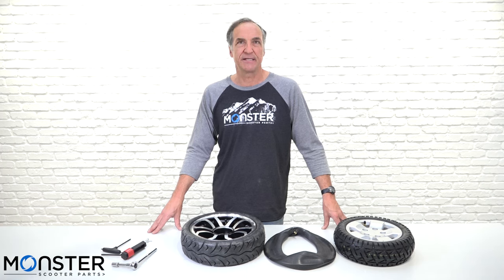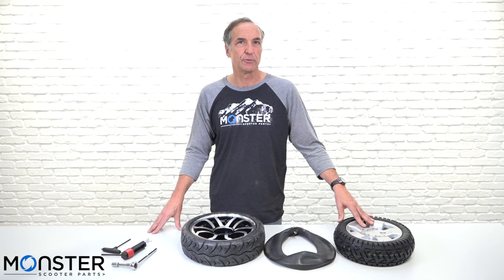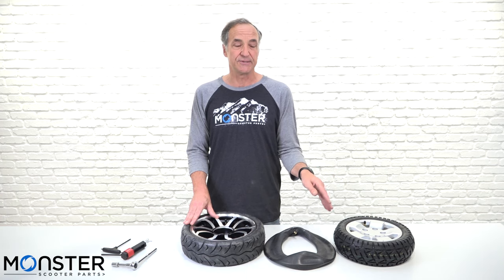Hi, my name is Dan. Today we're going to see how you can use a 3.00-8 tube in two different types of tires that are not the same size. One of these rims is going to be used on a Pride Pursuit XL or a Pride Victory XL and it's a 13x4. The other rim is going to be used on a Drive Cobra GT4 and it's a 14x4. Even though those are different sizes, you can still use this tube in both wheels and I'll show you how.